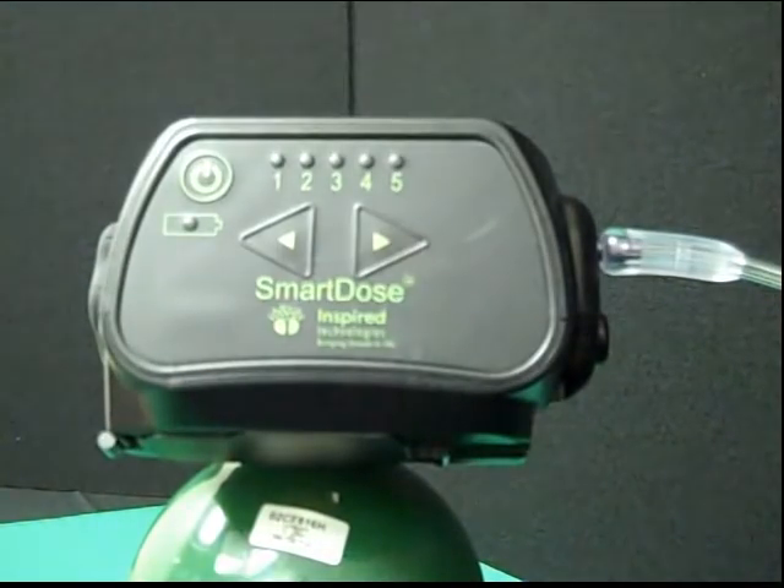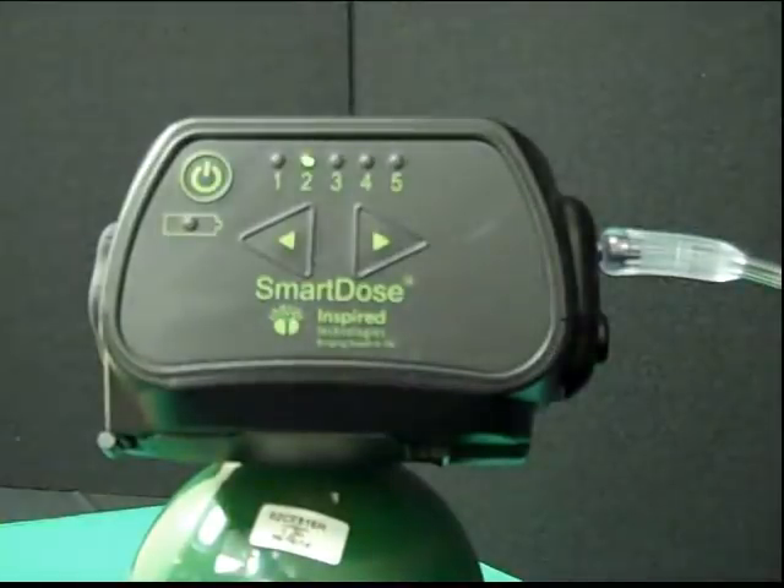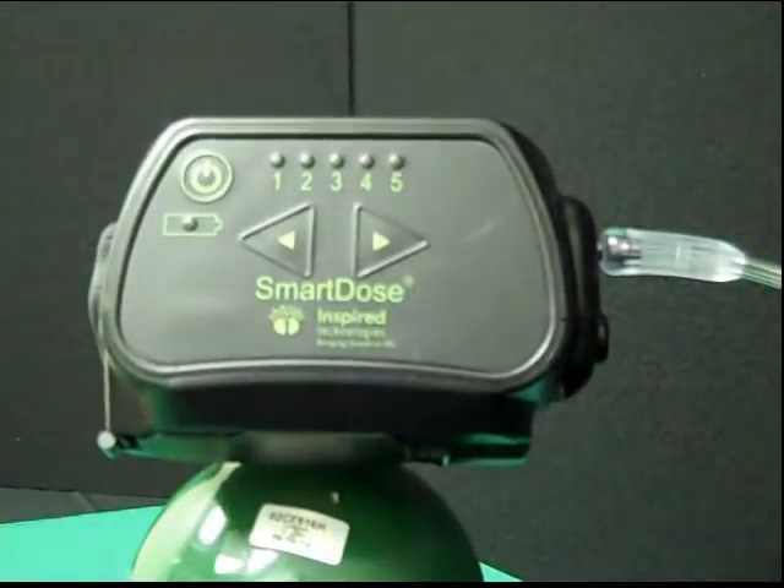As you breathe on the unit, a single indicator will light on each pulse to both tell you that the unit triggered as well as show you the current setting. This also helps train users who may have a tendency to mouth breathe to inhale through their nose for consistent triggering.